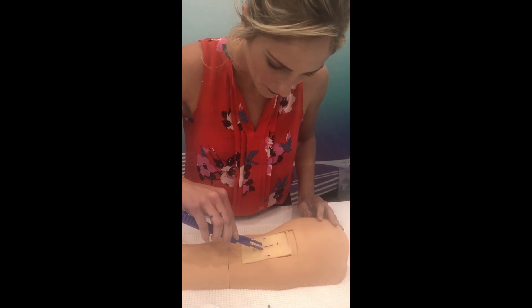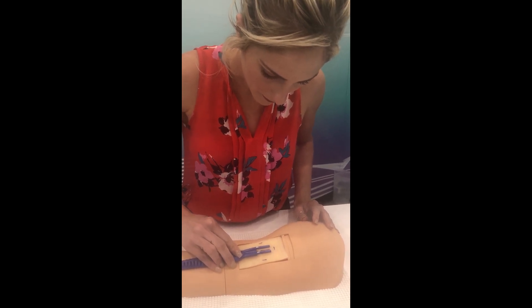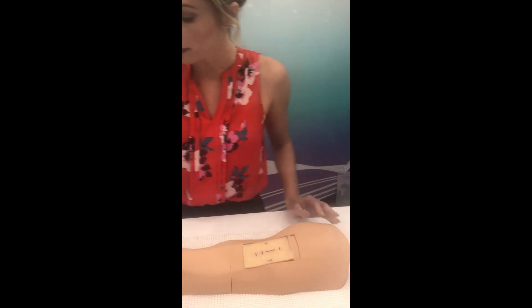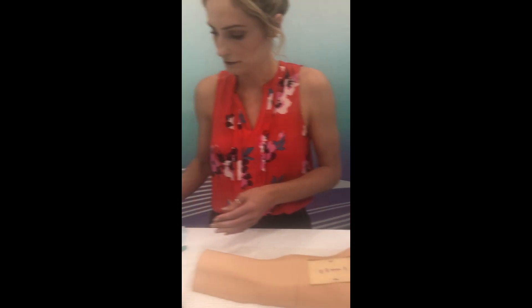When they touch, drop the foot. Go in, drop it. Right in. Beautiful. Pull it out — you just pull it straight out. Take the sensor holder. That's the insertion.